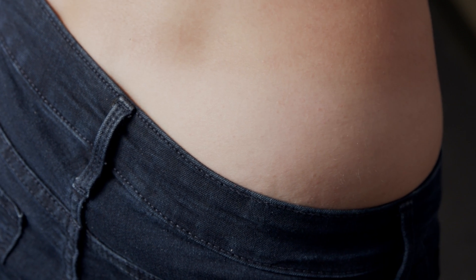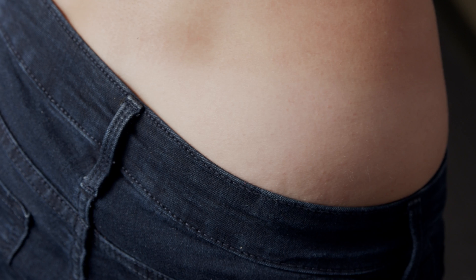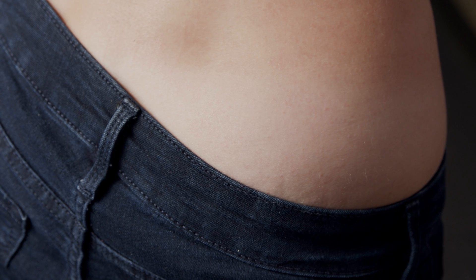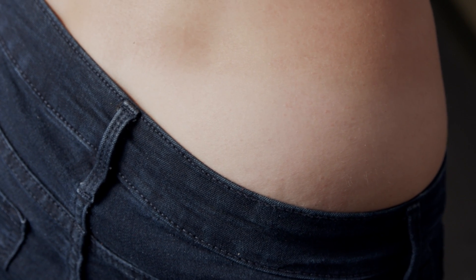The injection should be given in an intramuscular site specified by your physician. Wipe the injection site with an alcohol prep wipe and allow the skin to dry. Make sure to alternate the injection sites between both sides of your body.